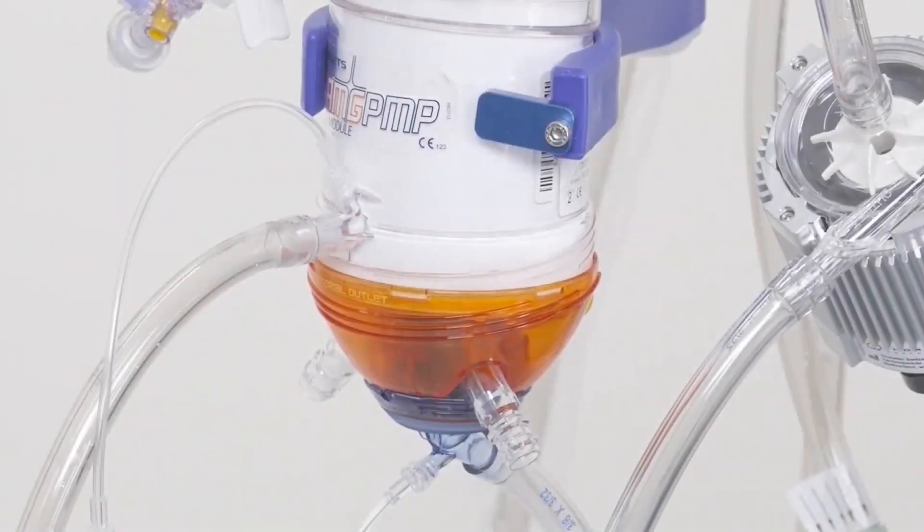Once the circuit is assembled, it's important to check the integrity of the heat exchanger prior to using the oxygenator. If any leaks are noted, obtain another oxygenator.